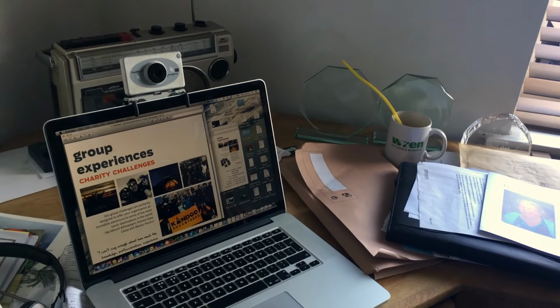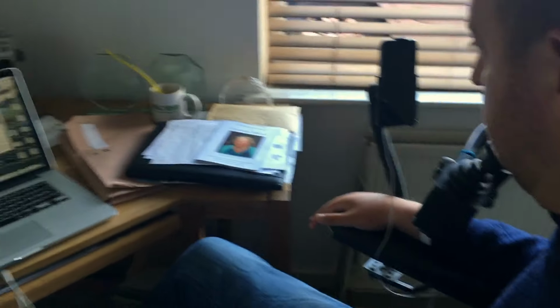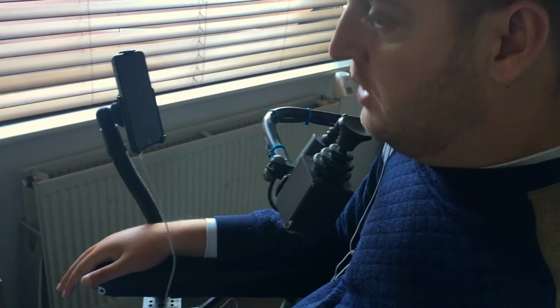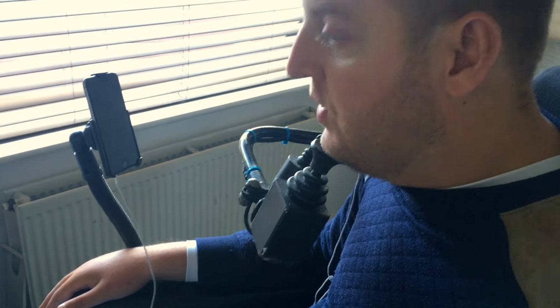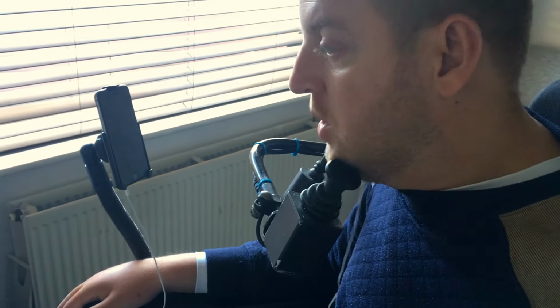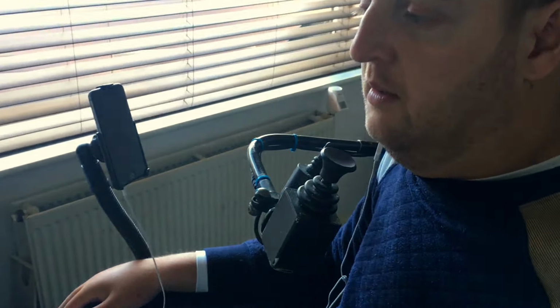Can you right click? Yeah, so the right click option, if I hover off this, again that's a PDF, so that wouldn't work. But on here, I right click, and that brings it up. Okay, so is that just moving your chin to the right? Simply, just as you would on a cursor. On a laptop, previous to my accident, I'd have a left option and a right option. Yeah. My left, as you can see, that selects it. Yeah. A double click. And then a right click. Okay. Brings up the menu.